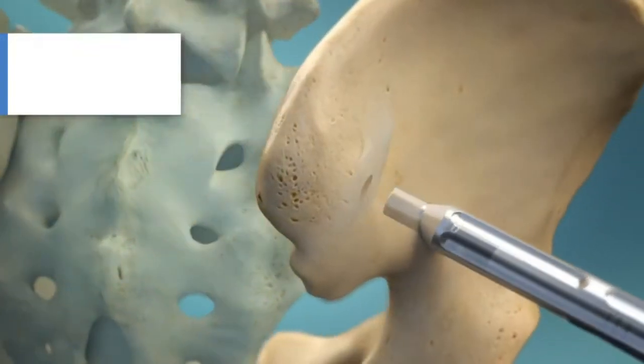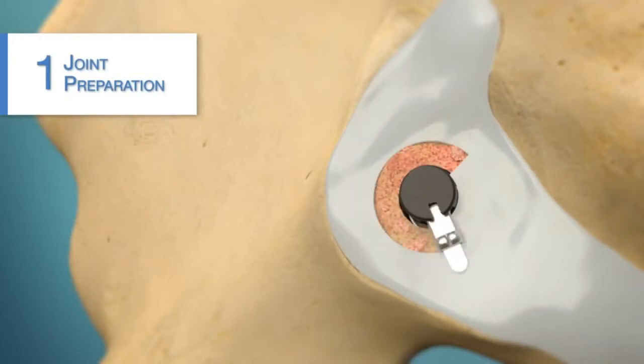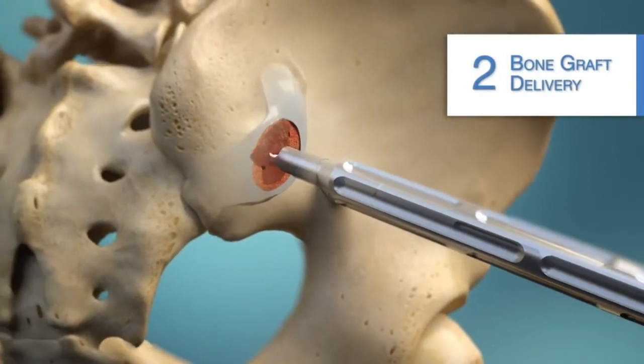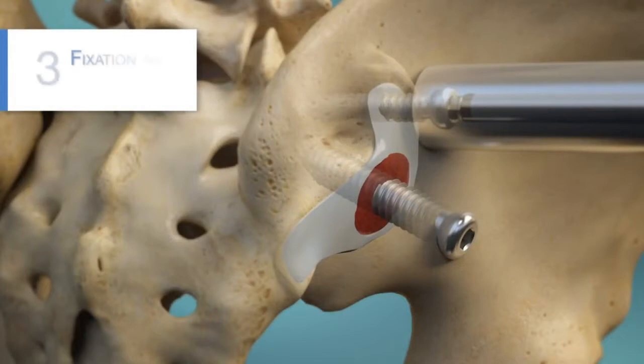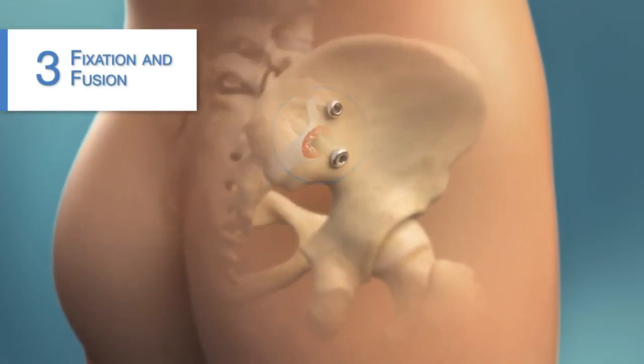The procedure begins by preparing the joint surfaces, removing cartilage to trigger the body's natural healing response. Next, bone graft is inserted to help bone grow across the joint. Implants are then placed to stabilize and prevent movement during the healing process. This allows true biological fusion to occur.